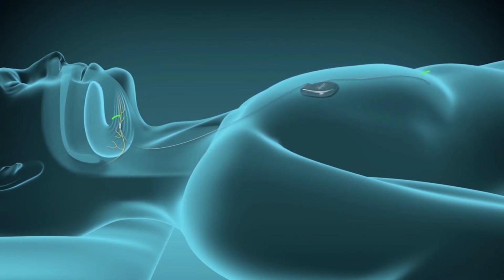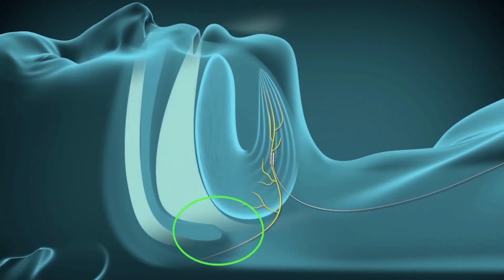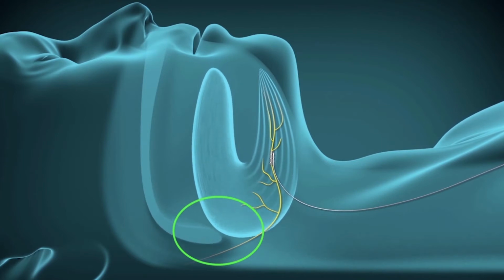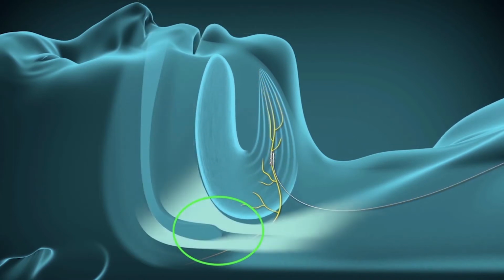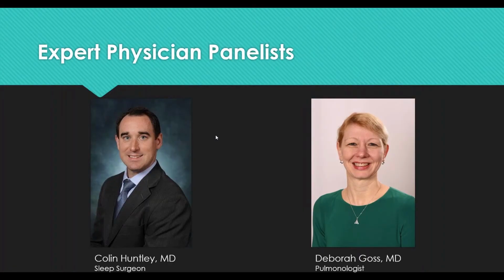When the patient activates the device at night before going to bed, there's a delay to let them get to sleep, and then after it kicks on, the respiratory sensor senses the change in pulmonary pressure, which sends a signal to the IPG, which in turn sends a signal to the electrode to stimulate the nerve, and the tongue will contract and move forward, and we hope that there's linkage to the palate as well to provide multi-level opening of the upper airway.